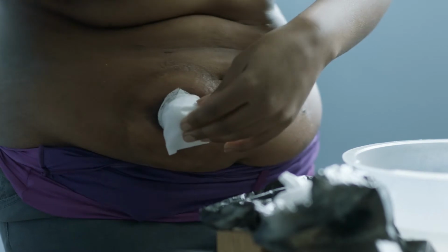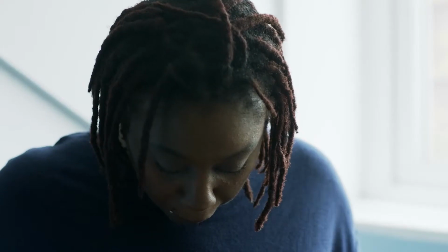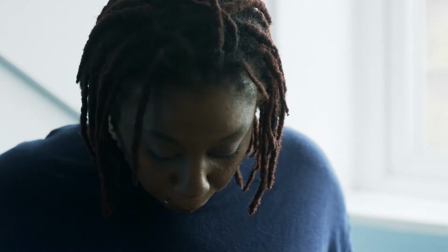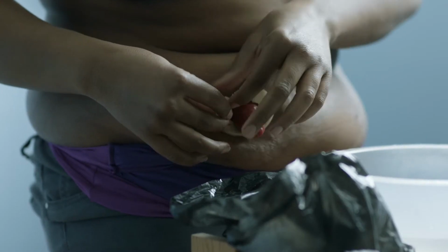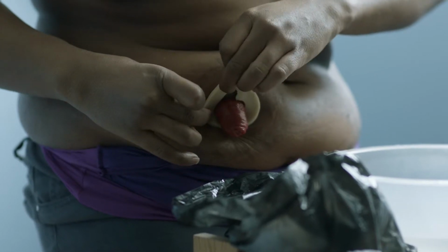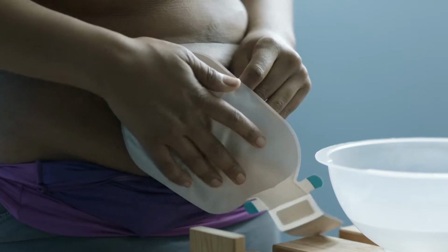Once I've put the barrier spray on, I like to make sure it dries because you need to have the dry skin before you can put the bag on. I then put a barrier ring, I take it out and I rip it and I make sure it's snug around my stoma. Not too snug, there needs to be a little bit of a gap, but I need to make sure that it's surrounding my whole stoma. And then I put my bag on top of that.